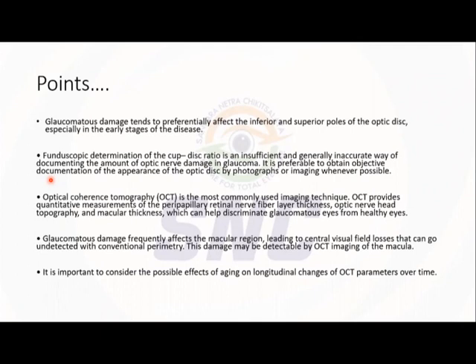Then OCT is the most commonly used imaging technique. It provides quantitative measurements of the peripapillary retinal nerve fiber layer thickness, optic nerve head topography, and macular thickness. So we can discriminate glaucomatous eye from normal eye.